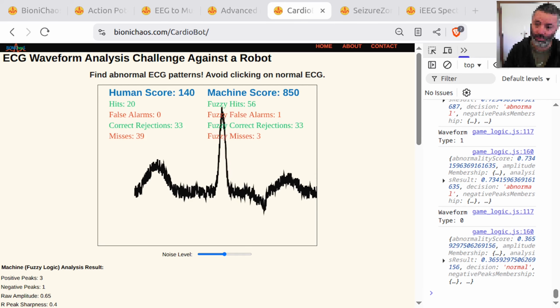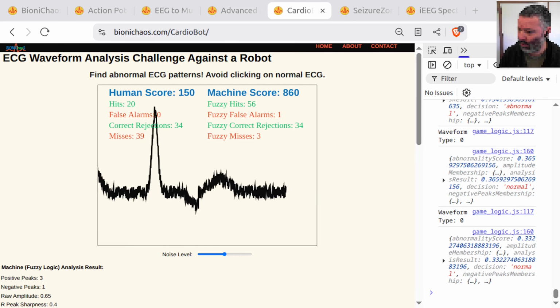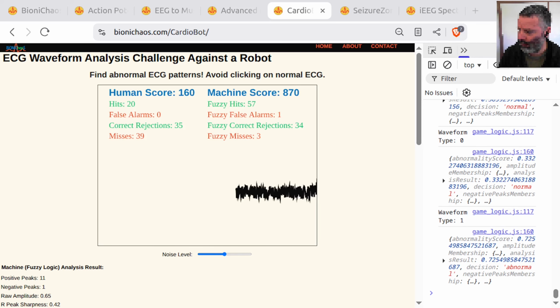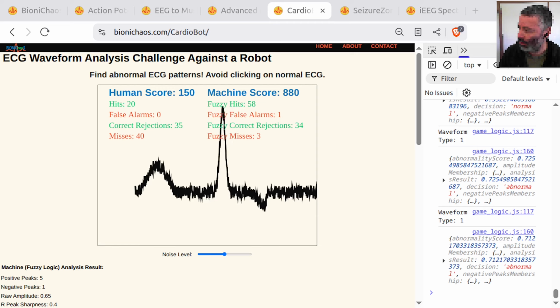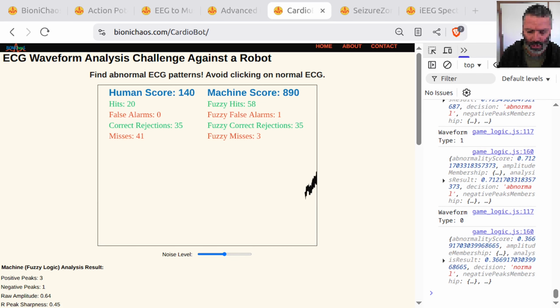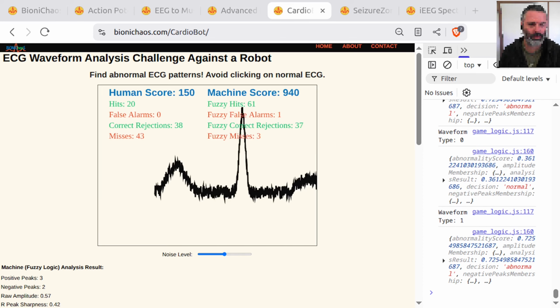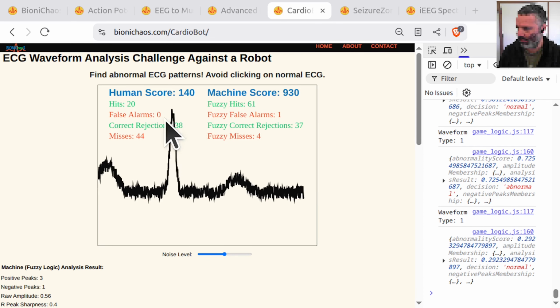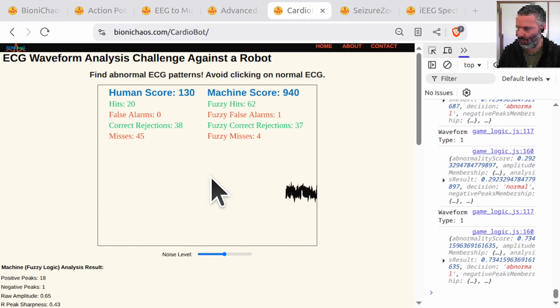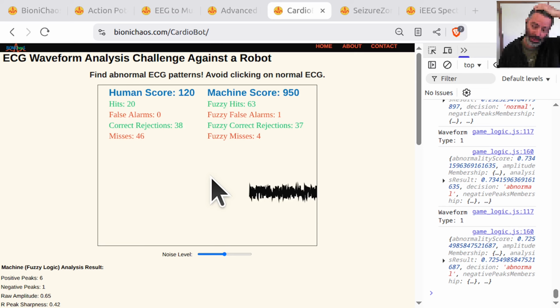Yeah, we used to rely on Flask quite a bit. We don't do that anymore. We'll have to redo it in vanilla JavaScript. The only thing we need out of it is those waveforms. We could redo them from scratch.